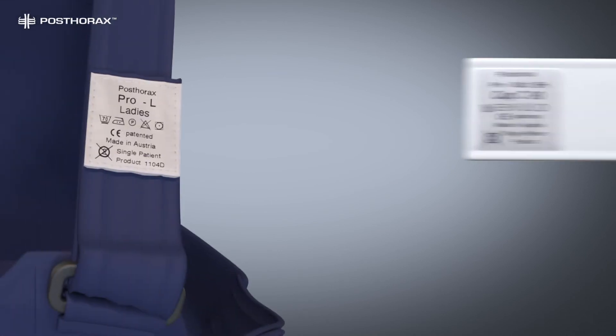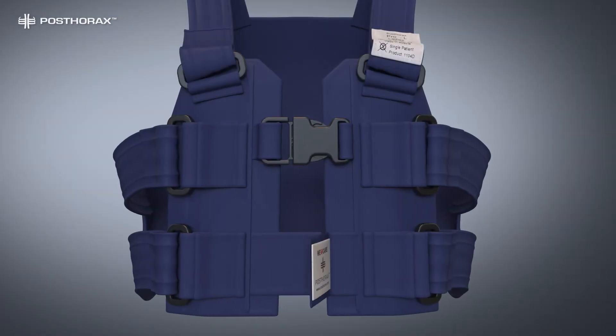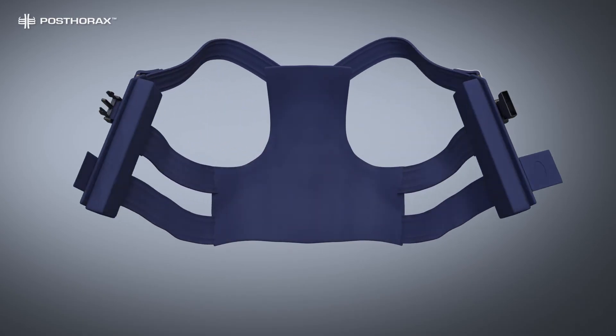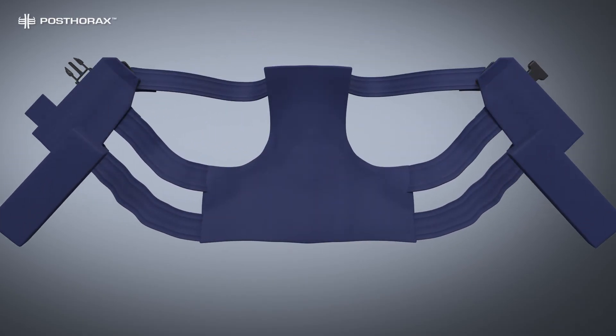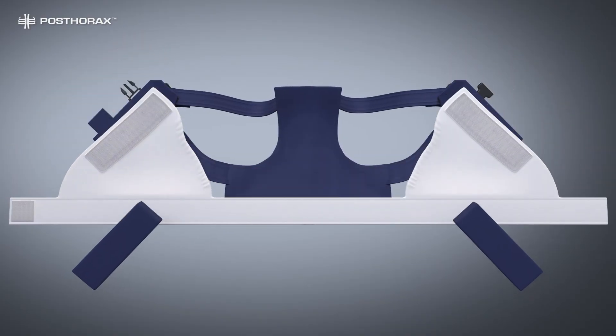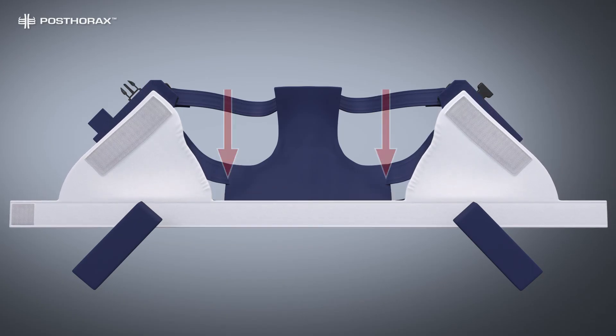Select the correct size of the support bra and vest. Open the clip and velcro of the support vest and attach the two support cushions. Now attach the support bra to the front velcro. You have the choice to place the bra higher or lower depending on breast size to achieve a perfect fit.